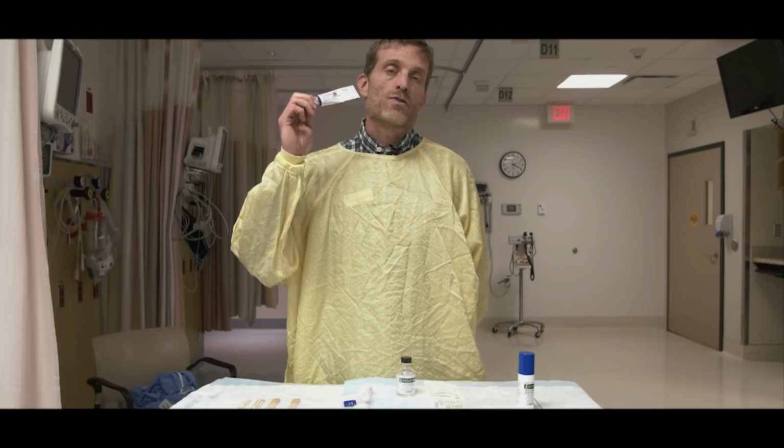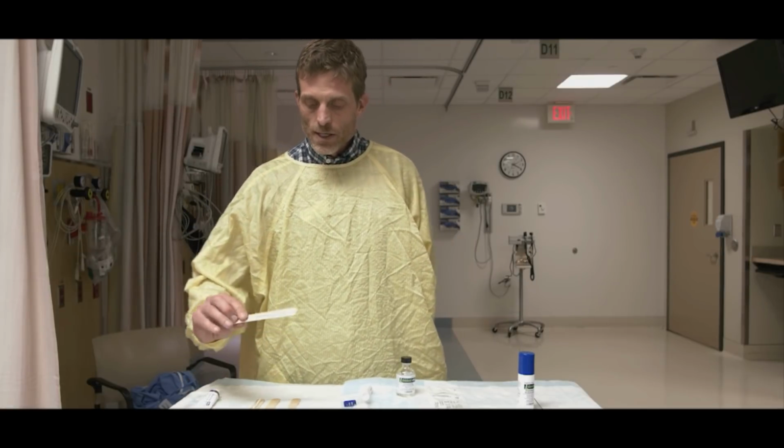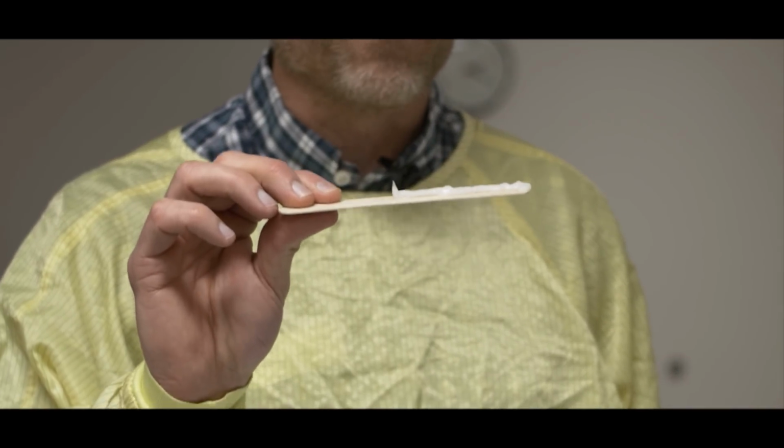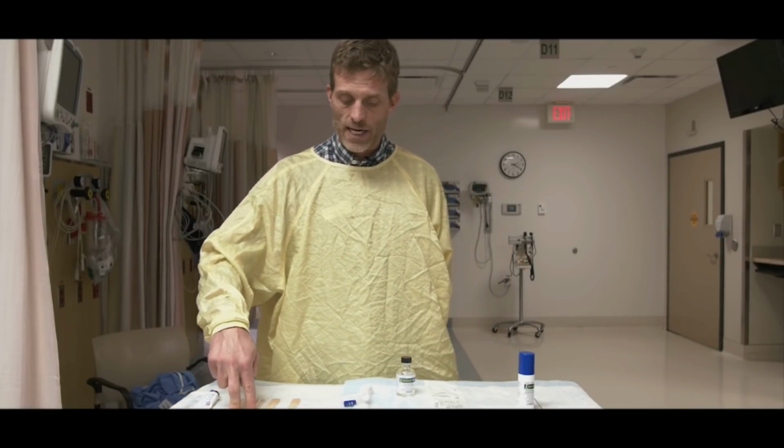Again, this is 5%, so this is 50 milligrams per 1 gram of ointment. I went down to pharmacy and weighed all this out. This is 80 milligrams of lidocaine. It's about 1.6 grams of ointment. So I prepared 2 of those. So we have 160 milligrams of lidocaine there.